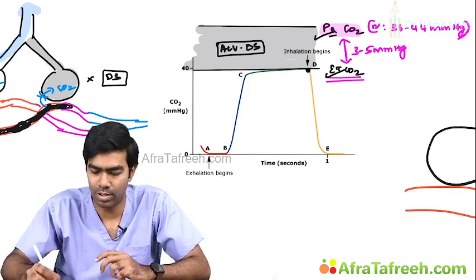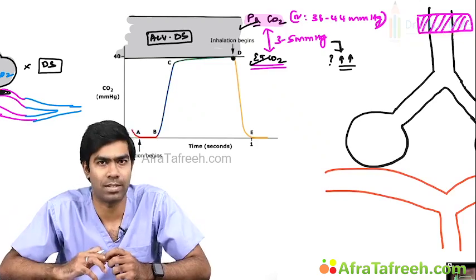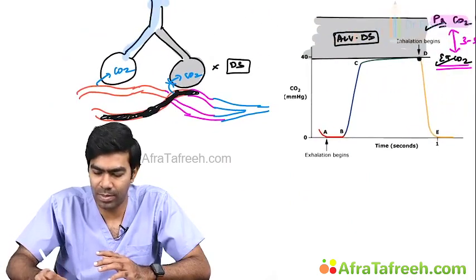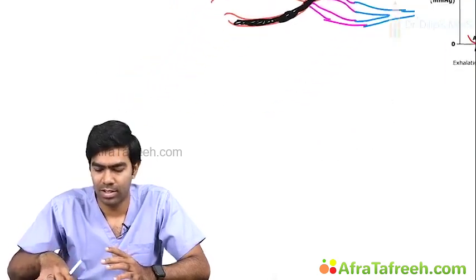So that's the next question. When the gap will expand, which means when the PaCO2 and the EtCO2 gap will keep increasing. Very simple. So now I can tell whenever the alveolar dead space is increasing, the gap also will expand. When the alveolar dead space will increase, let us go back to the original respiratory failure equation.